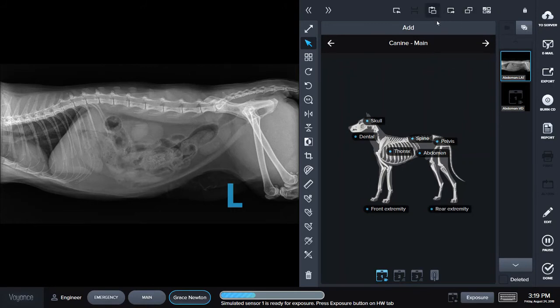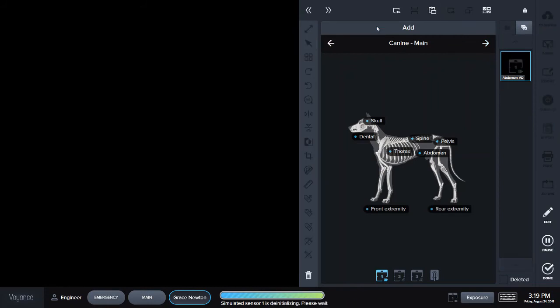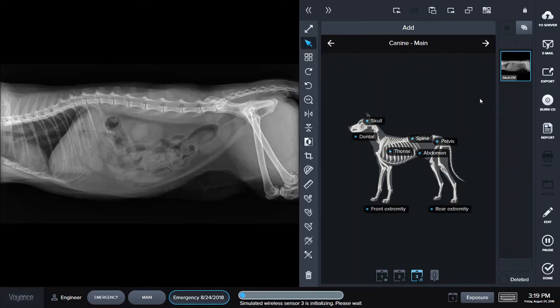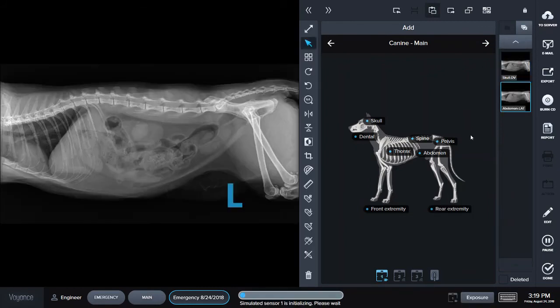I can also paste images from other places on my computer. So if I select this image and I cut it, it takes that image from this patient, and then I can paste it here with one click. This is very unique to this system — no other system has this.